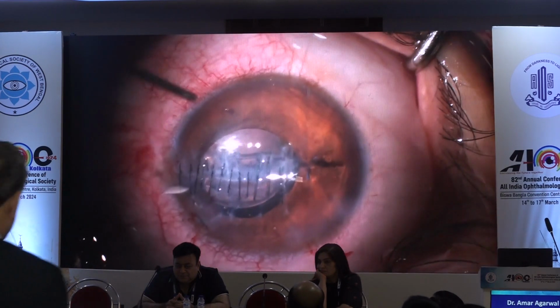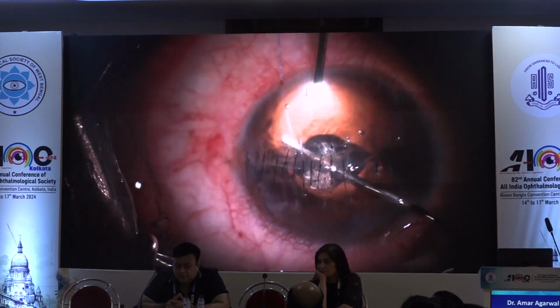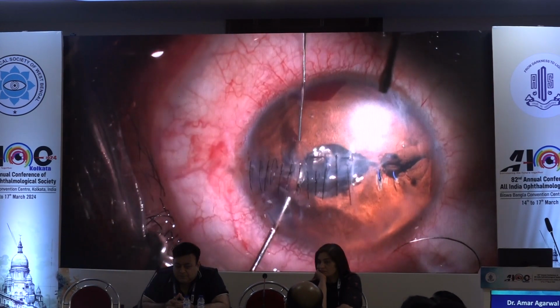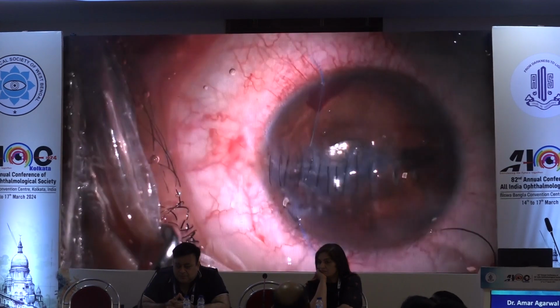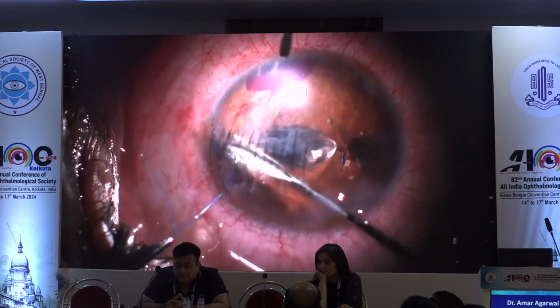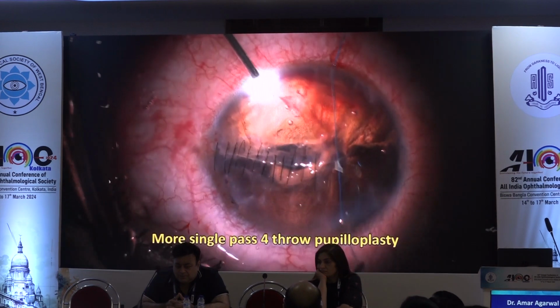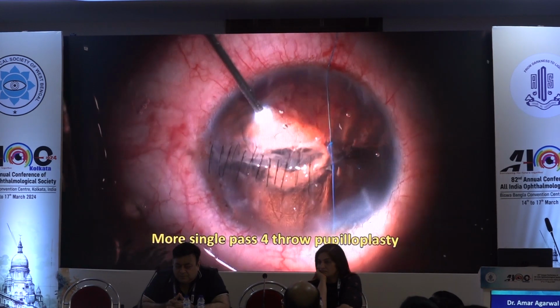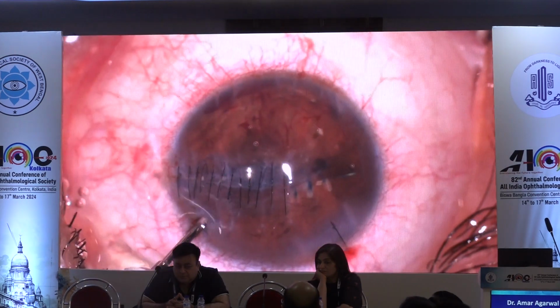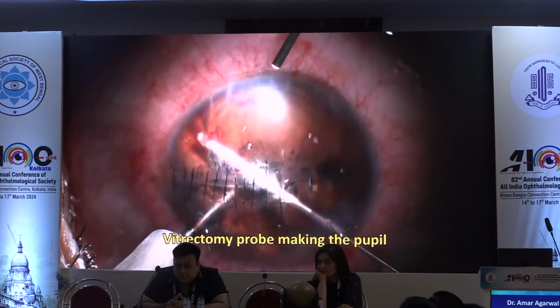Now important is, please understand, if this scar is off-centered from the cornea center, it is very easy for me to do. But here you notice it is really near the center. Understand my problem here, that's the challenge I'm facing. So now, when I do my pinhole, I have to keep it exactly bang on track. I have to miss the scar, and I have to see my Purkinje image also bang on track. Now I'm just saying, can I do it or not? Worst comes to worst, if it didn't work, I knew I'm making a pinhole, later on I'll do a PK. And my pinhole will anyway solve the problems.